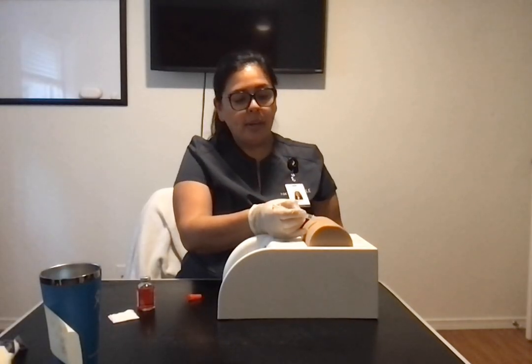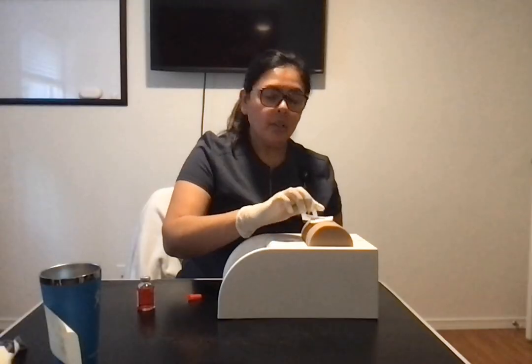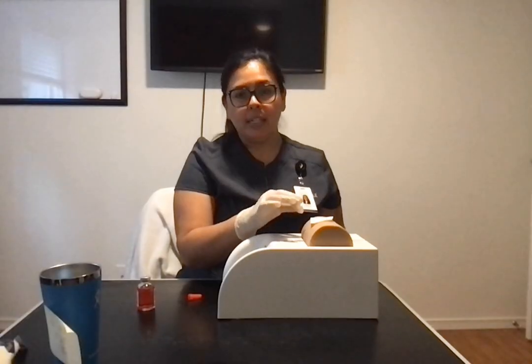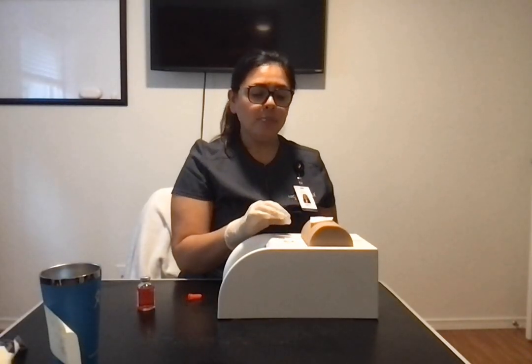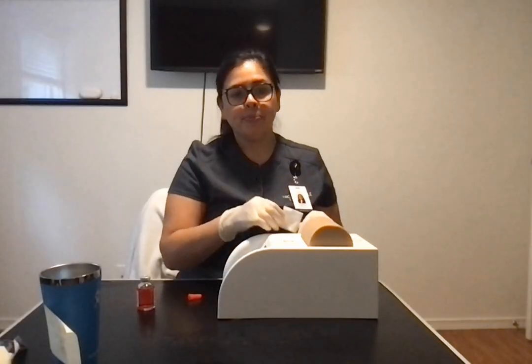So then at that point, I would remove the needle, dispose of it in the sharps container, gently lay on top a clean gauze, in case any of the medication leaked out, or if there's any slight bleeding from the initial penetration of the needle. Making sure that it's okay. I don't want to press on it because I don't want any of the medication to come out. Go ahead and throw that away.